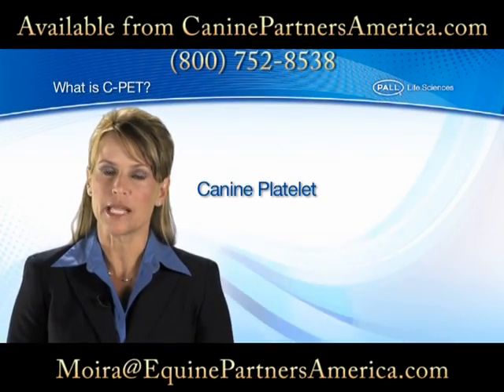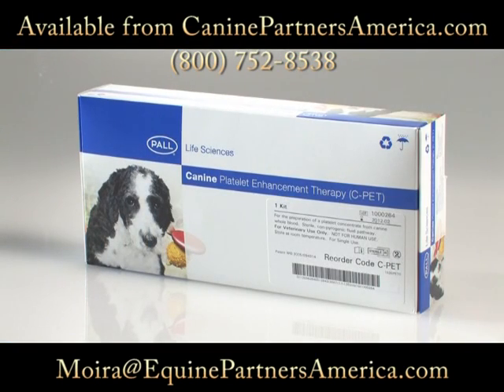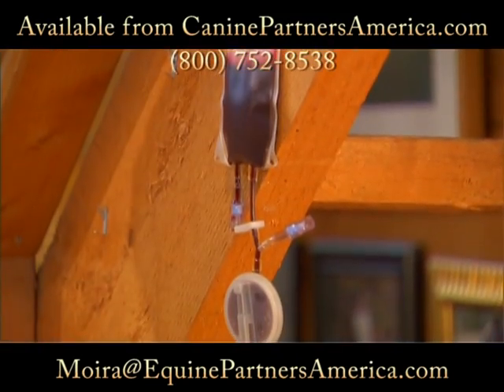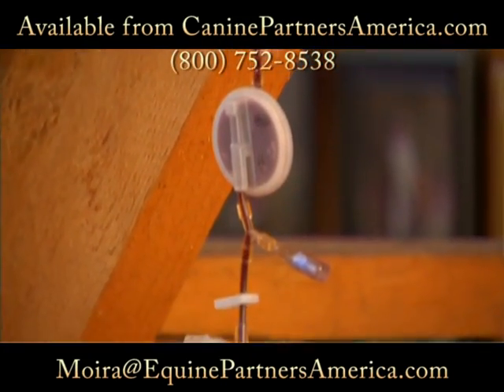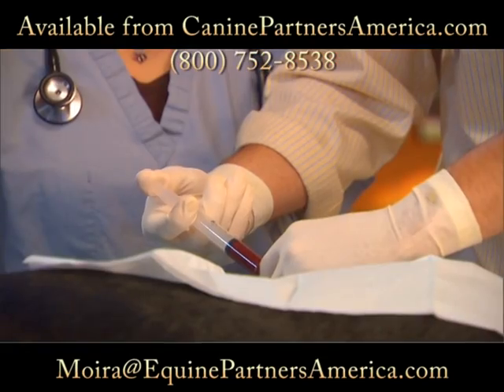It's called the Canine Platelet Enhancement Therapy System, or simply C-PET. And this is it. The C-PET system allows your veterinarian to use just a small amount of blood from your dog, process the blood with the C-PET system to create a high concentration of platelets, and then inject the recovered platelets made with your dog's own blood into the diseased or injured joint.